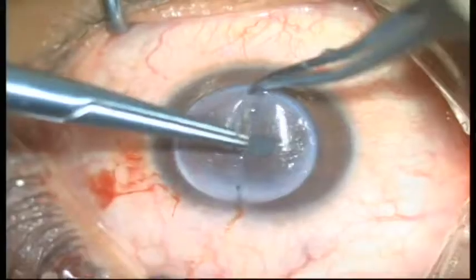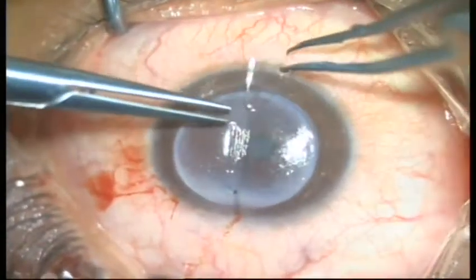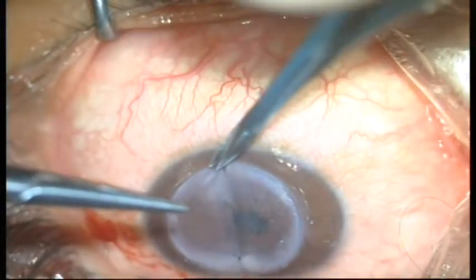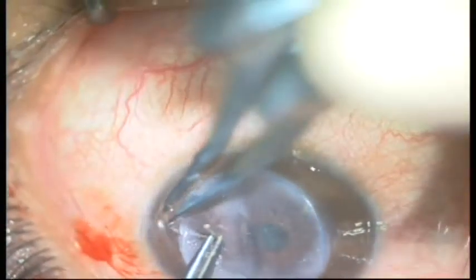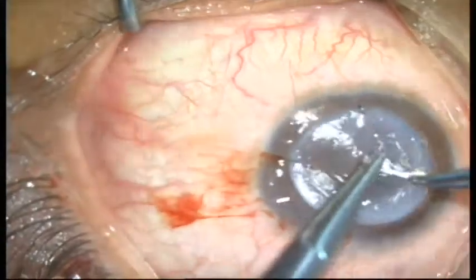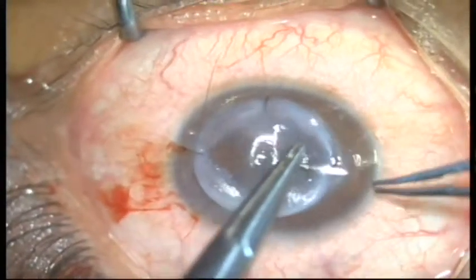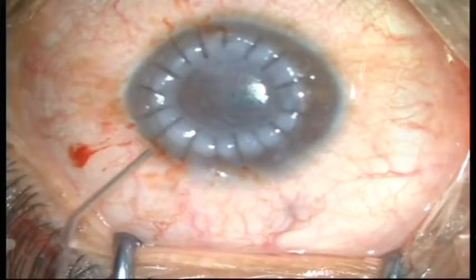with no difference in the ectatic diseases in order not to induce myopia. After taking the cardinal sutures, the 12 o'clock one, and then the most important, the 6 o'clock, to divide the cornea into exactly 2 halves, then taking the other 2 at 3 and 9 o'clock to create a cruciate-like gutter of the cornea, then taking the 16 sutures.